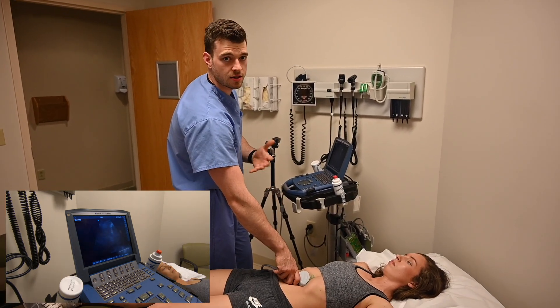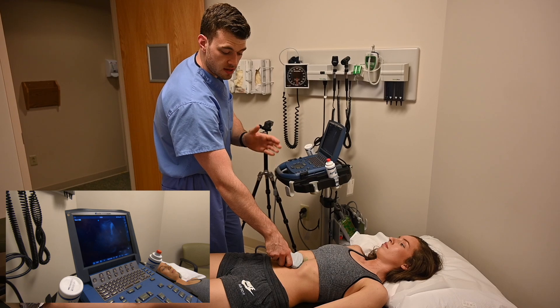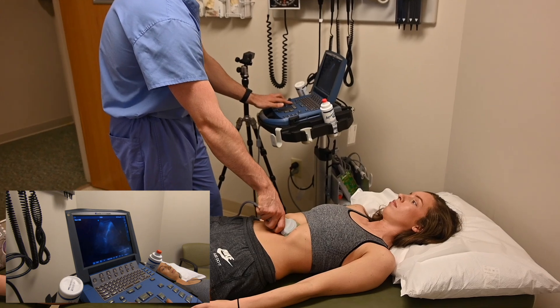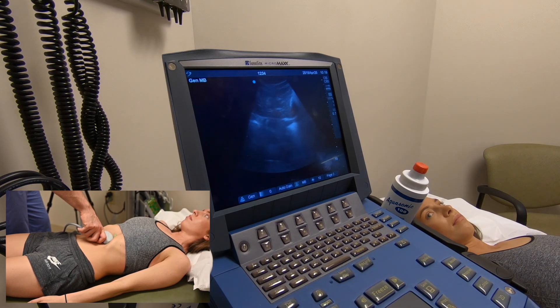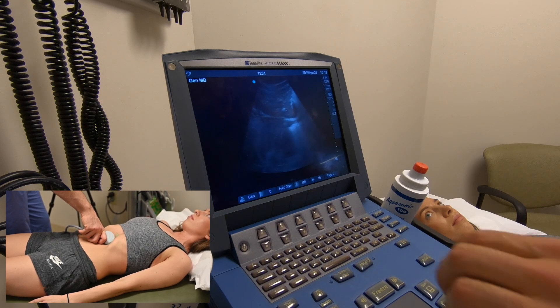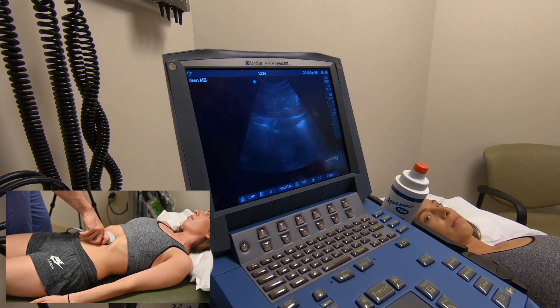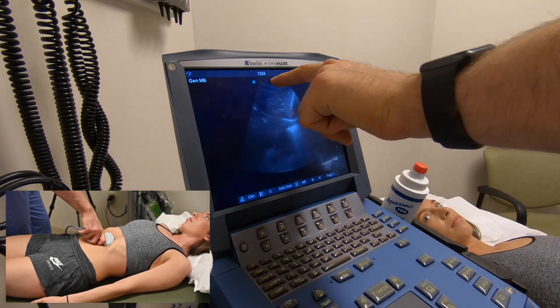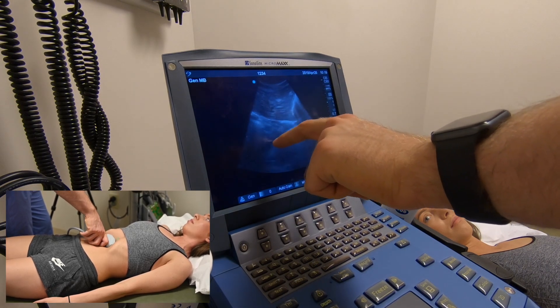Now we're doing the cardiac portion — just a quick look, not a full echo. This is the sub-xiphoid view. With the curvilinear it's not ideal, so I've increased the depth. If we push down and Stephanie takes a deep breath in, the heart pops in and we can see the chambers contracting. We're looking for a bright stripe as the pericardium and ensuring there's no fluid around it. We're using the liver as a window — the probe is pressing through and shooting through the liver to get the heart. No pericardial fluid is seen.